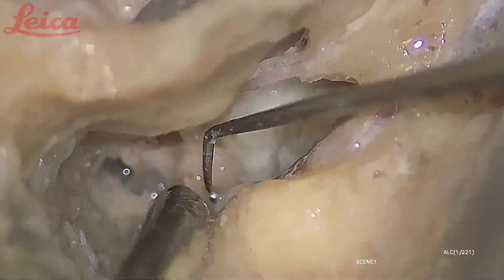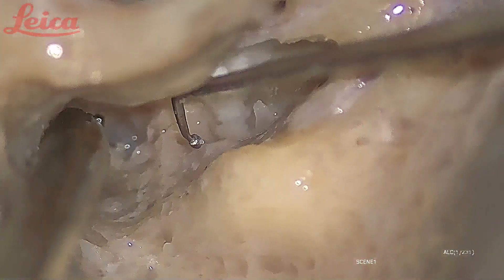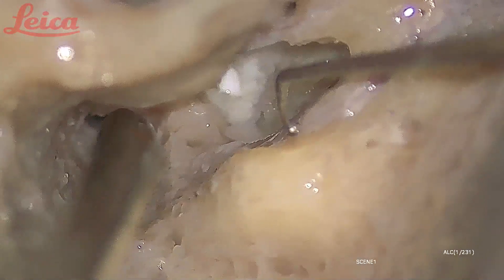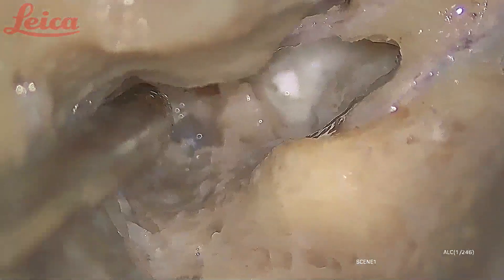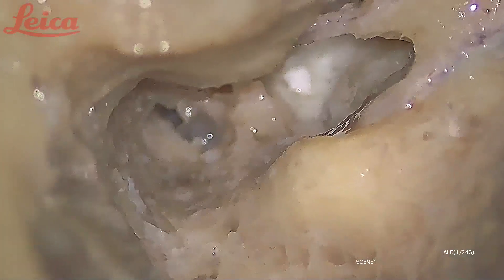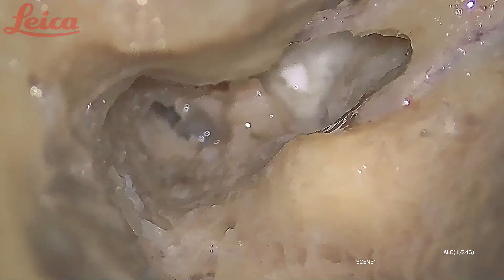These are all the supra-labyrinthine cells. I have now delineated the nerve up to the horizontal segment — this is the horizontal segment of the facial nerve, this is the second genu, and the rest is the vertical segment. To further go proximally you have to fracture the process cochleariformis.